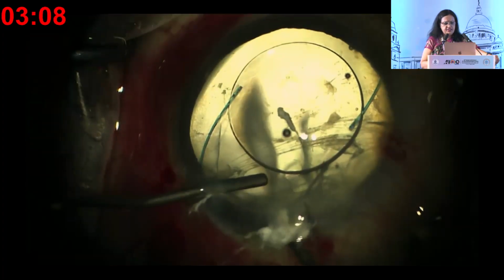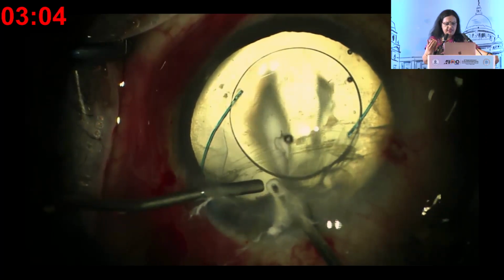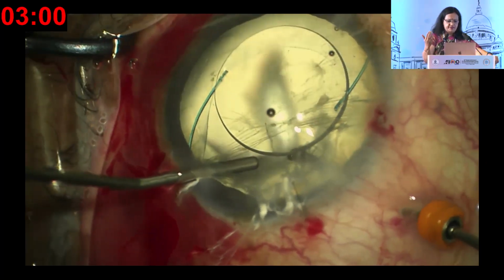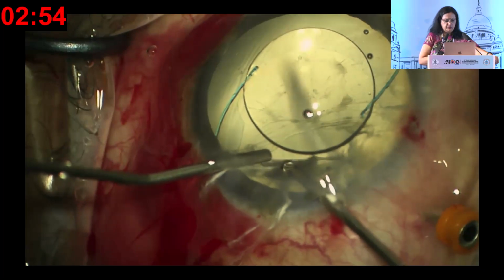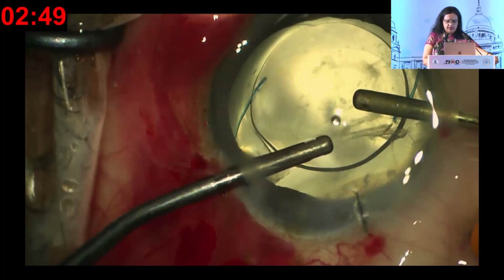The advantage with this method is the vitreous gets cut off from where it gets prolapsed. Whereas if you do an anterior vitrectomy at this point, it continues to prolapse. You may cut, but more will come, more will come. So when you go from the bottom and you cut off the vitreous, then it falls backward and you are able to completely clear the vitreous.